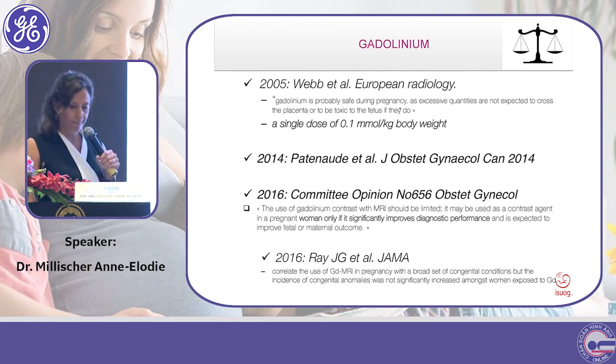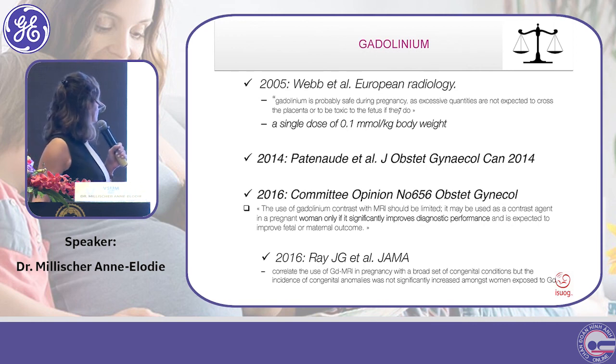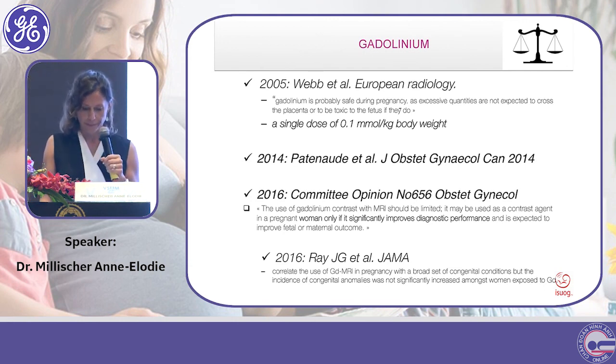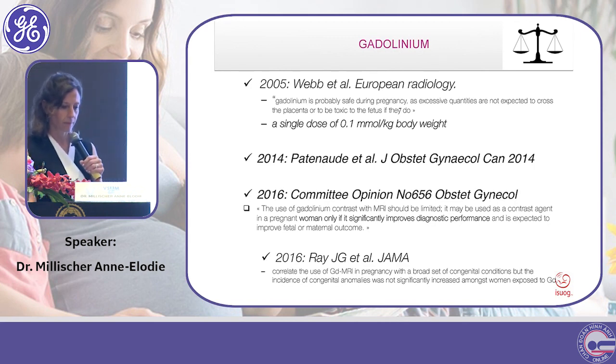Và khi mình khảo sát một cái nghiên cứu trên những cái bác sĩ mà mới làm về cái bệnh lý này thôi, thì mình thấy là khi mình tiêm thuốc vô thì cái khả năng chẩn đoán chính xác của những cái bác sĩ mới này nó sẽ tăng cao, tương đương với lại những bác sĩ mà đã lâu rồi.